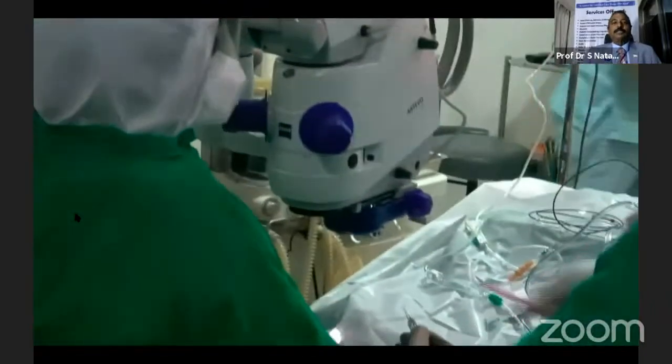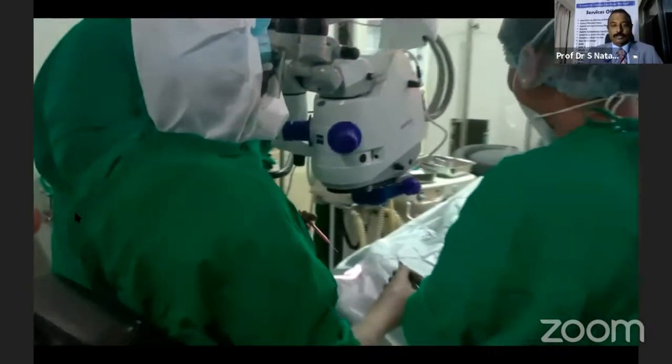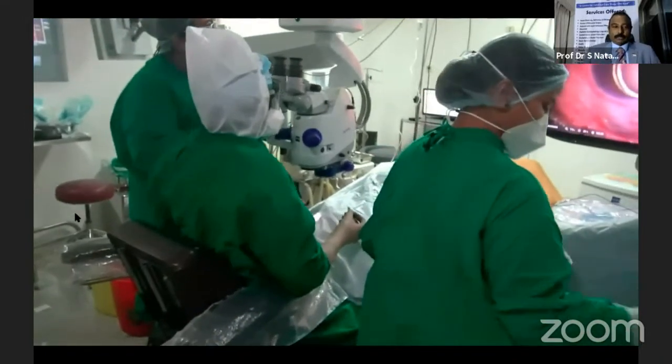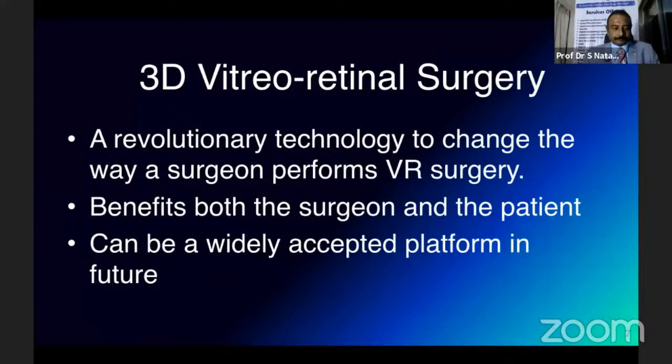And then you can see here, this is particularly the Zeiss, as I said, I don't have any financial interest, but you have the oculus. If you are not comfortable in the beginning, you can use the ocular, but I have turned off the oculus, and I'm watching the screen, and that's what you see here.